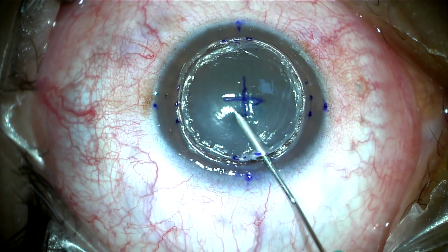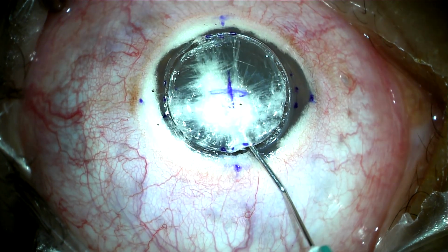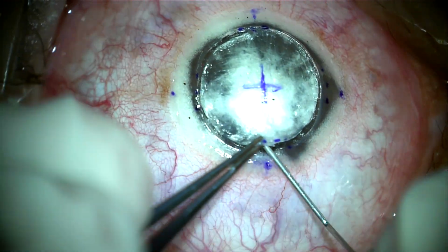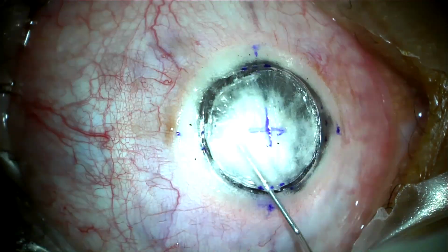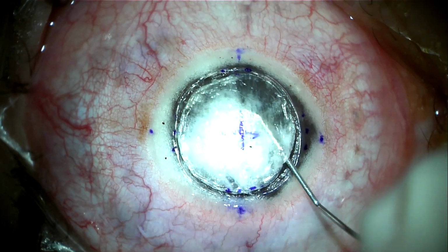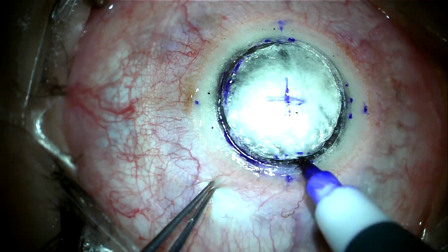In macular corneal dystrophy there is usual resistance and difficulty in air dissection to the stroma. It is to be noted also that in macular corneal dystrophy it is very common to have a type 2 bubble, or a mixed bubble, or a failed big bubble. After multiple air injections, stromal whitening occurred with no bubble formation.